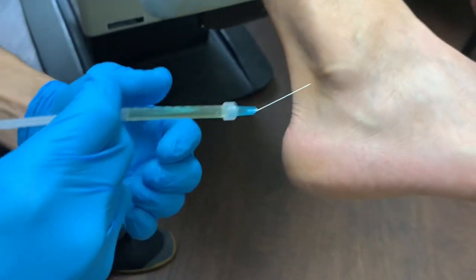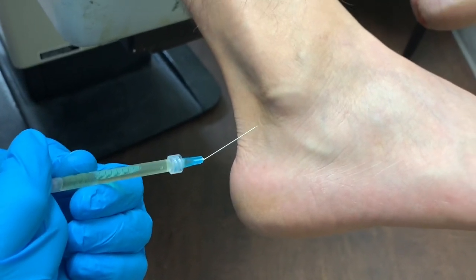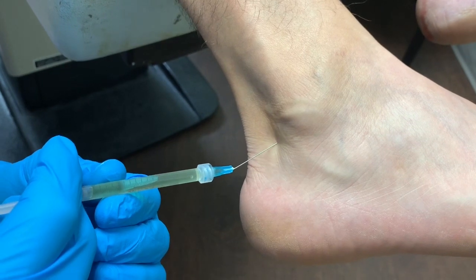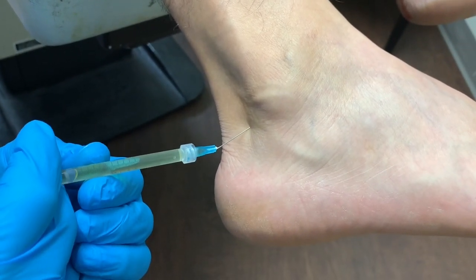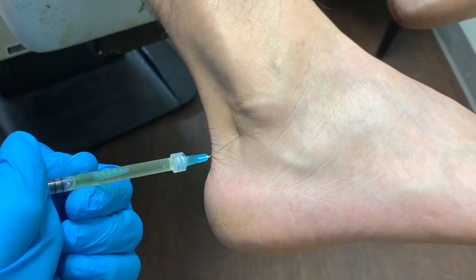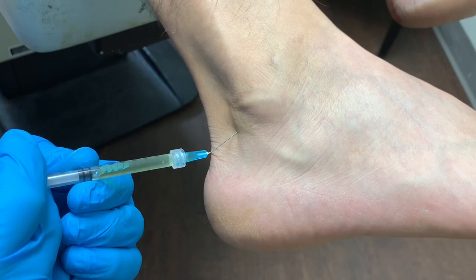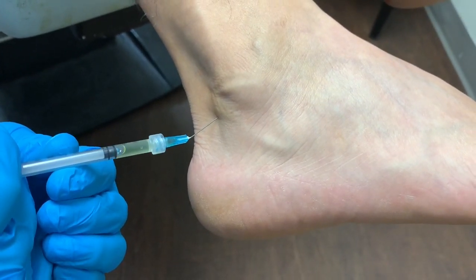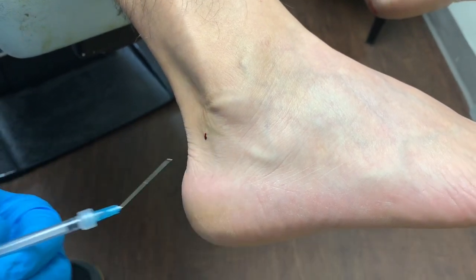Stick, stick, stick — and now dull pain. This is what we call a trigger point PRP injection. And we're done here — one cc of liquid gold inside the foot.